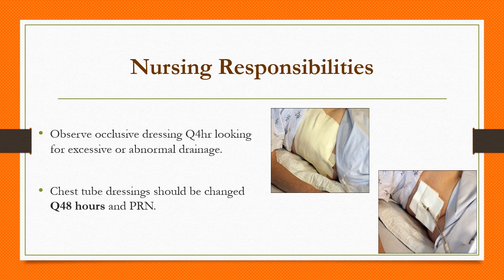Wash the skin around the chest tube insertion site with mild soap and water. Apply a new Vaseline gauze dressing to the chest tube directly at the site of insertion. Cover the chest tube insertion site with drain sponges and 4x4 gauze. Cover the dressing with occlusive tape. Ensure that the chest tube is taped to the skin to prevent accidental dislodgement.